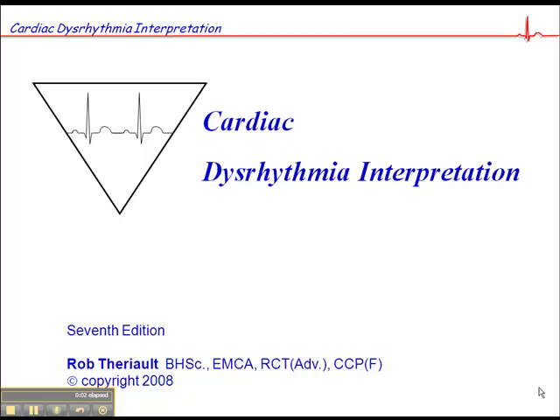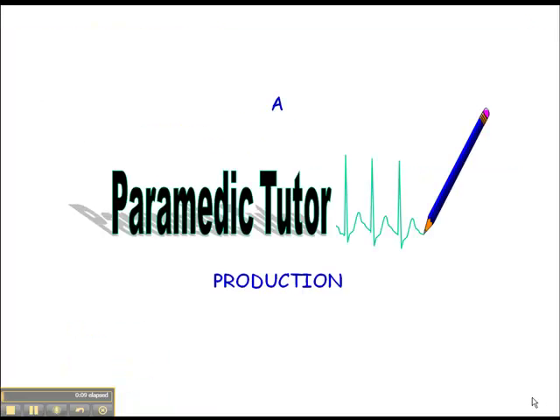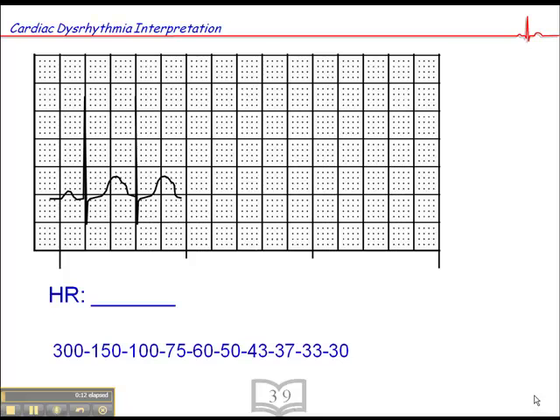Now we're in part four of the Cardiac Arrhythmia Interpretation Workbook. This is on page 39, and we're going to go through some heart rate calculation exercises. Remember that you get a digital readout with your cardiac monitor, but sometimes it's inaccurate because of the presence of artifact. You can count the number of complexes in the six-second strip and multiply by 10, but that's not as accurate as this method.